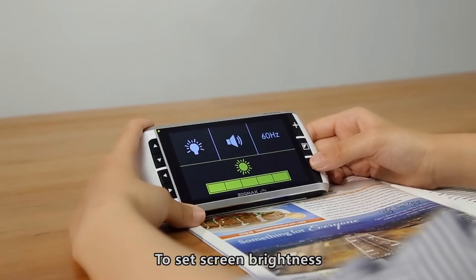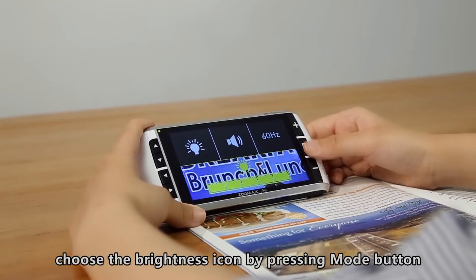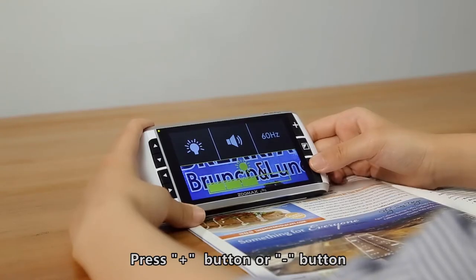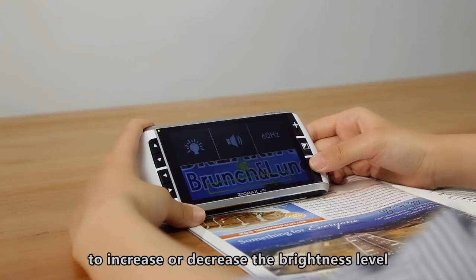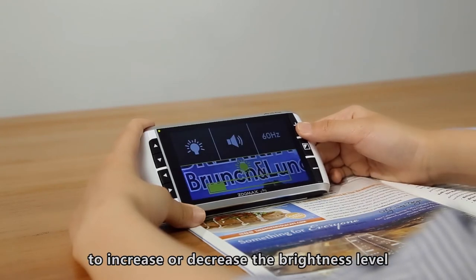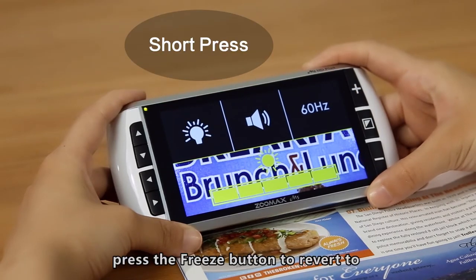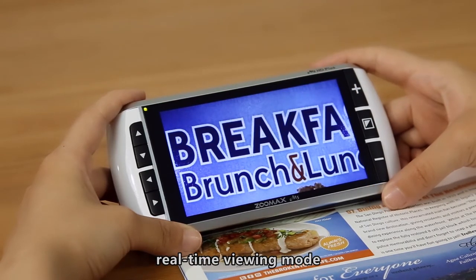To set screen brightness, choose the brightness icon by pressing the Mode button. Its background will turn to real-time viewing mode. Press the Zoom In or Zoom Out button to increase or decrease the brightness level. To exit the menu mode, press the Freeze button to revert to real-time viewing mode.